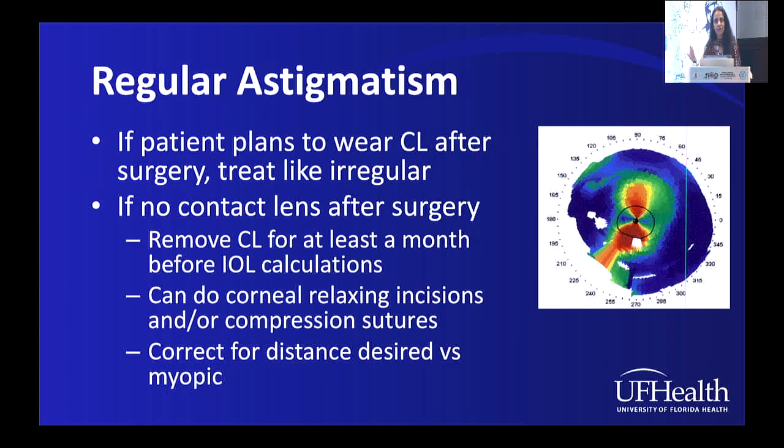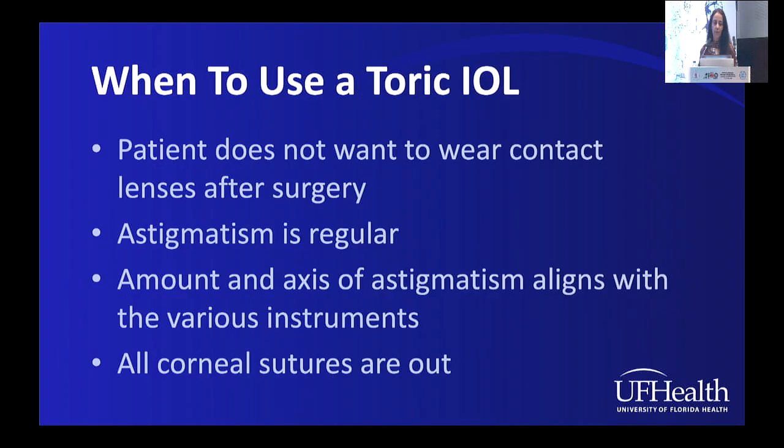And that, again, gives you a little bit of wiggle room, because they can always move things if you're not right on the mark. We saw some of the talks about how do you do measurements in irregular corneas, and a lot of these apply to the PK, so I won't reiterate those. But you do want to maybe give yourself a little bit of wiggle room when you're doing these surgeries, because they don't always end up right.